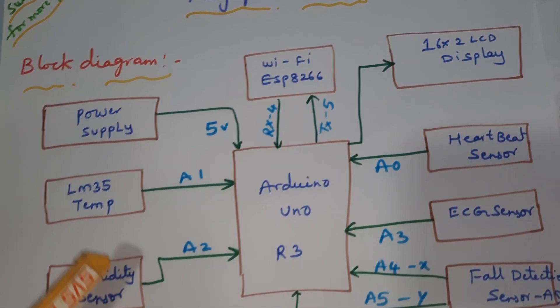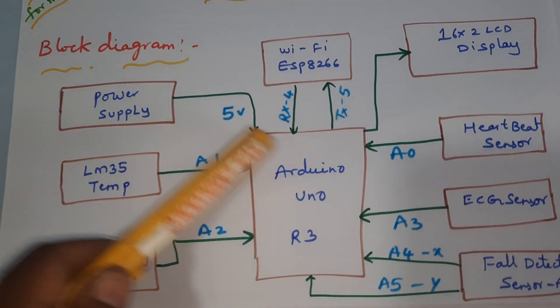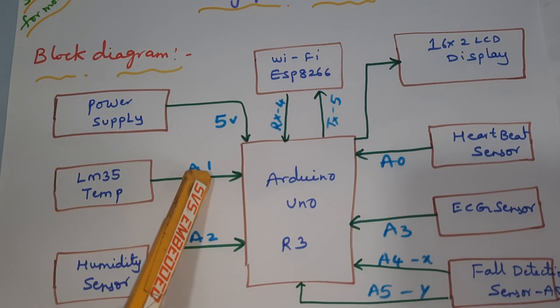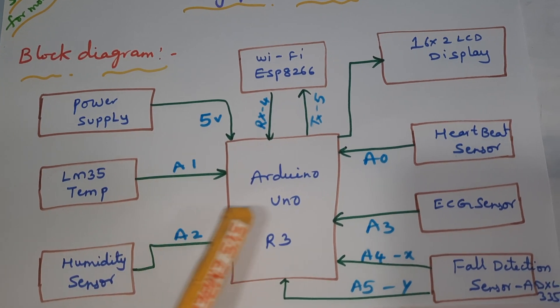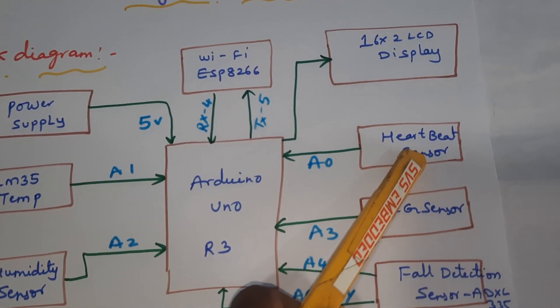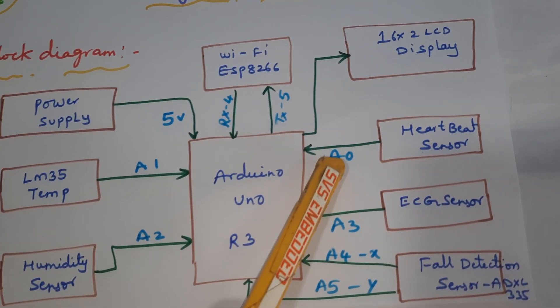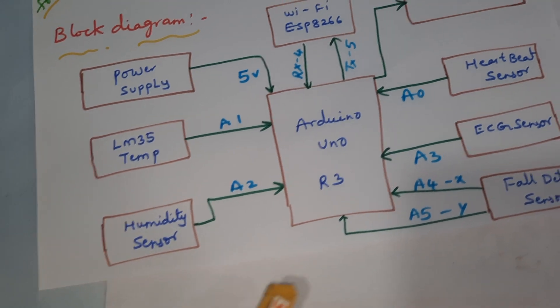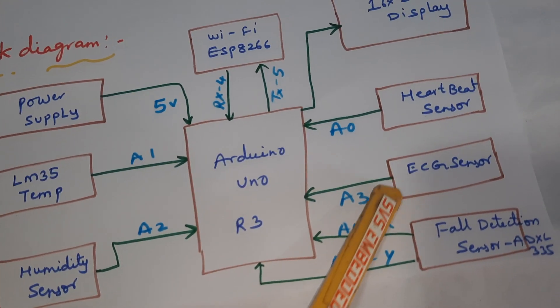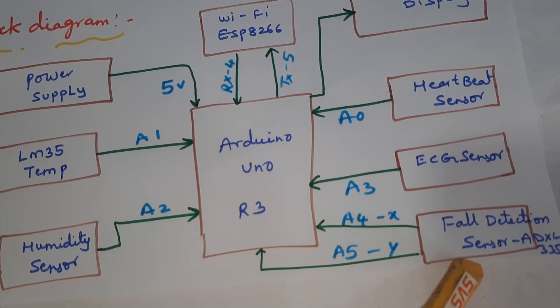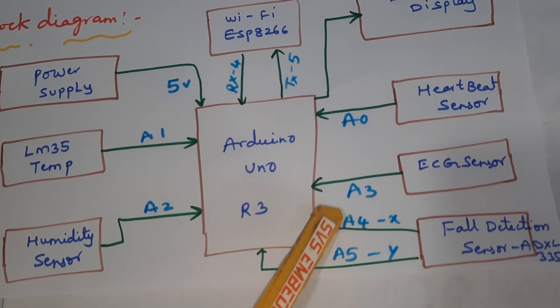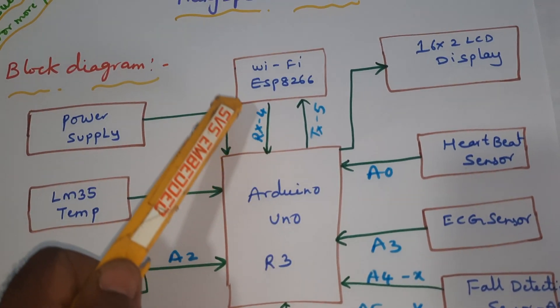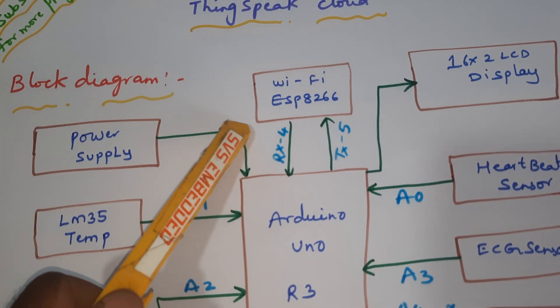Using a 5-volt power supply. LM35 temperature sensor is connected to A1, heartbeat sensor to A0, humidity sensor to A2, ECG sensor to A3, and fall detection sensor is connected to A4 and A5. The Wi-Fi module is connected to the fourth and fifth pin.